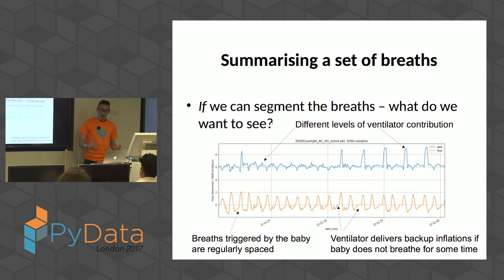In this trace, you might just say, but it's easy, Ian. Look, you just look at that zero line, and whenever it starts to go up from there, that's the start of a breath. And would that it would be so easy.